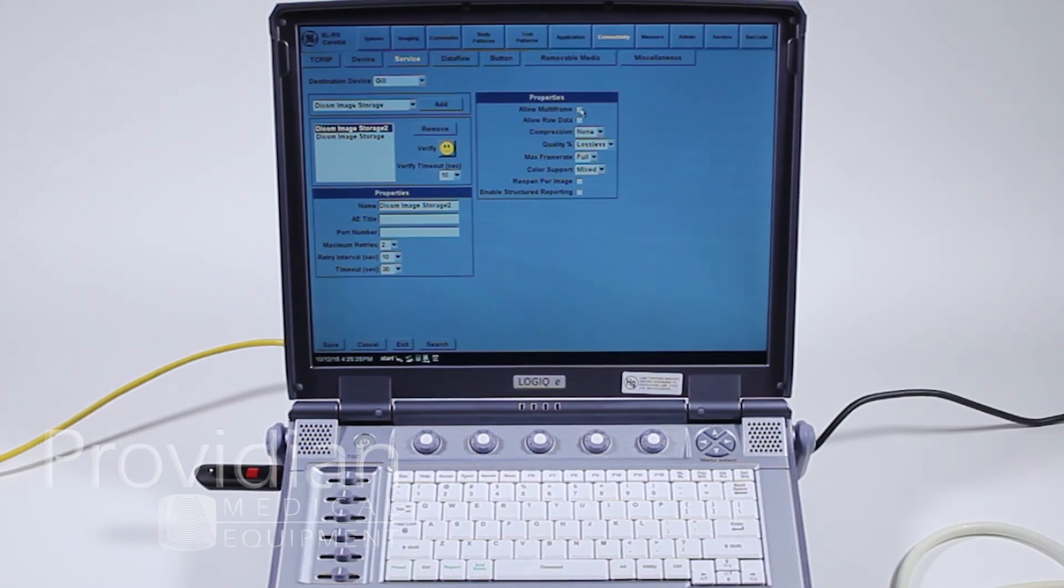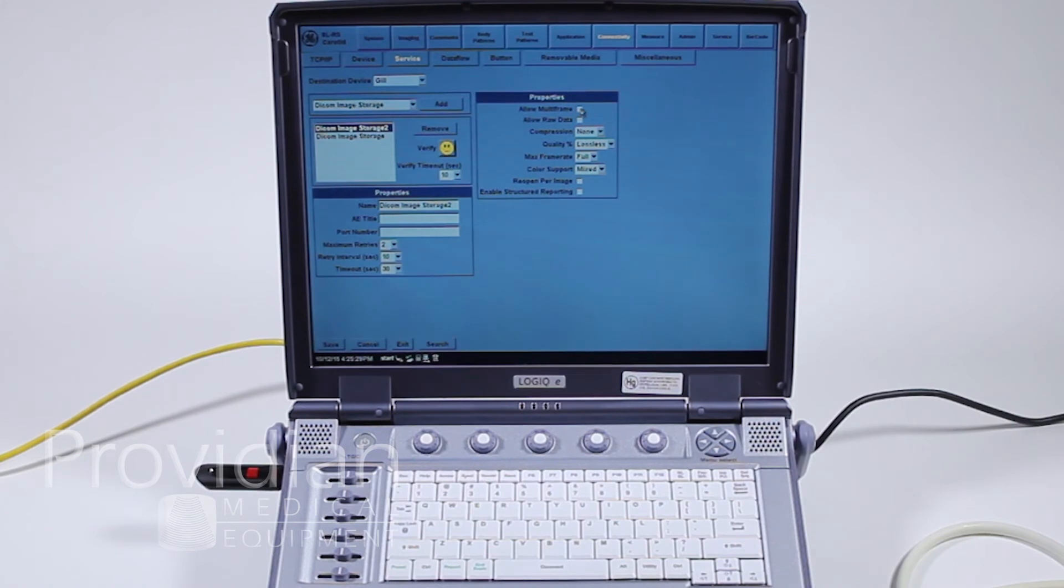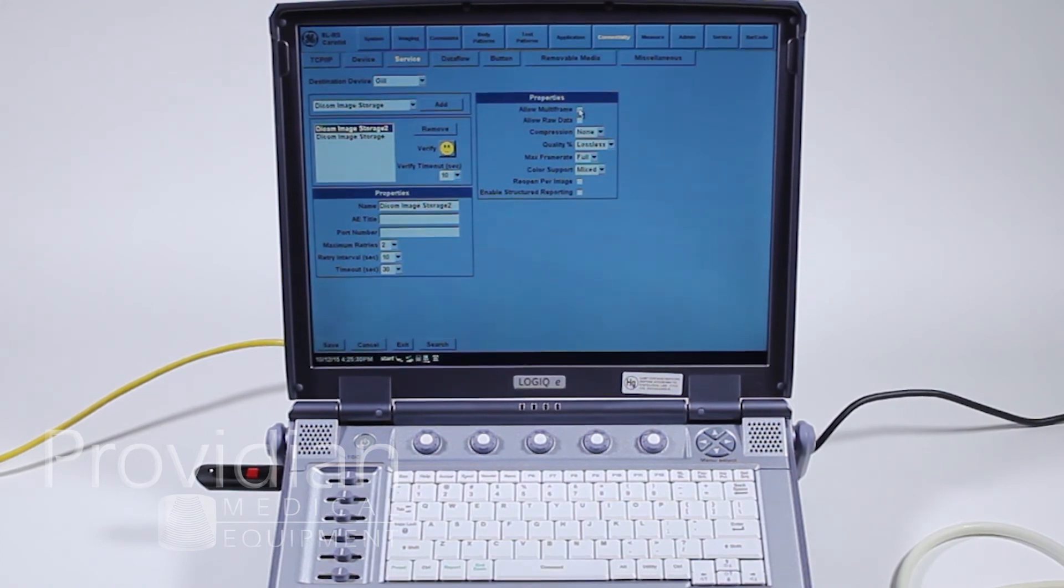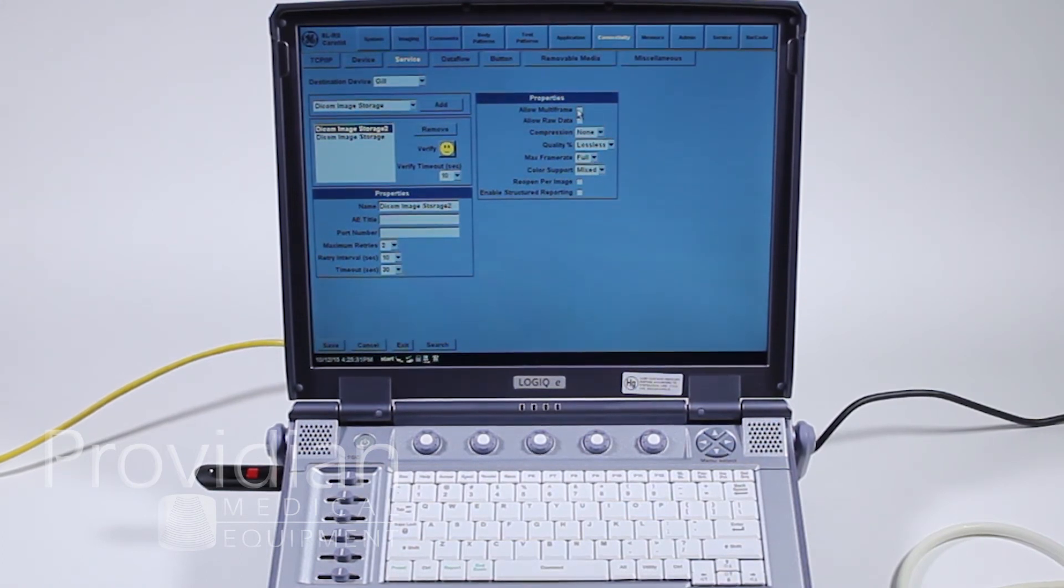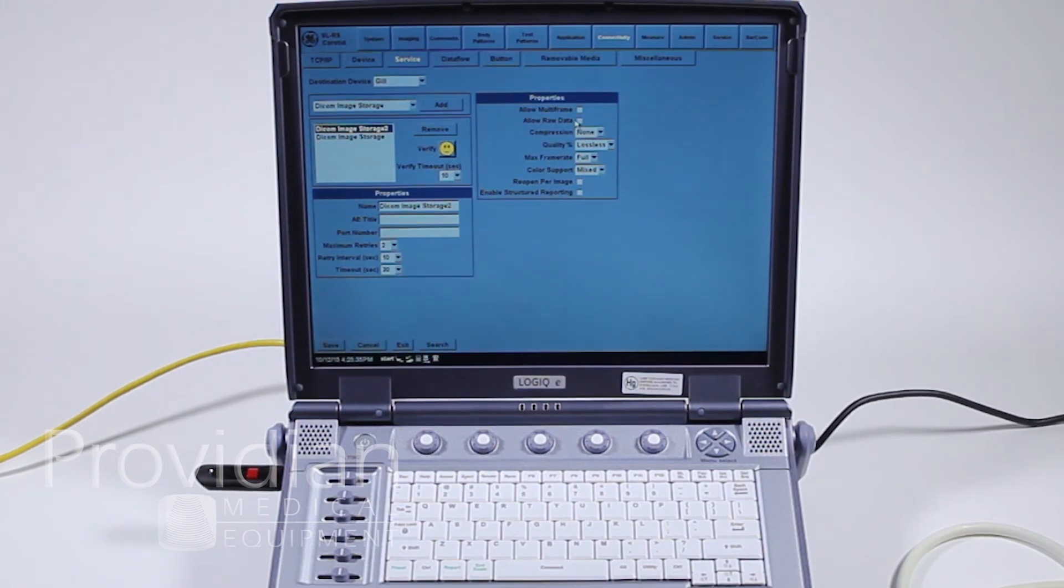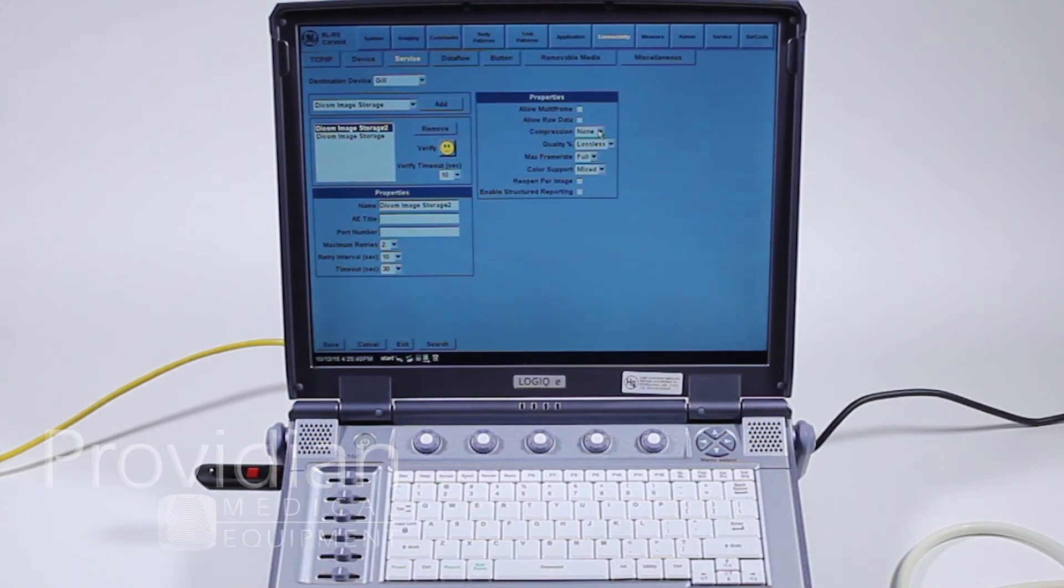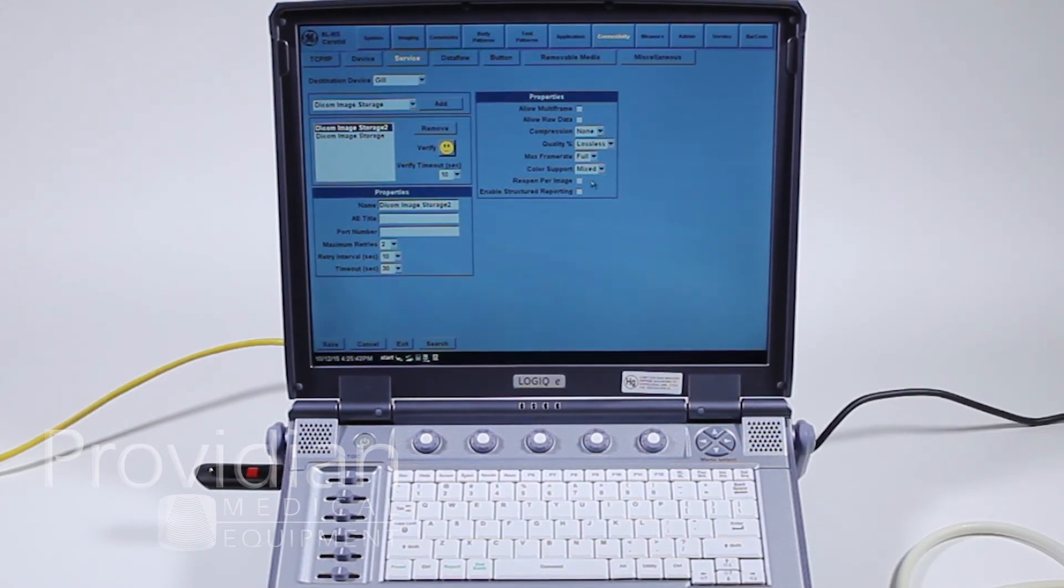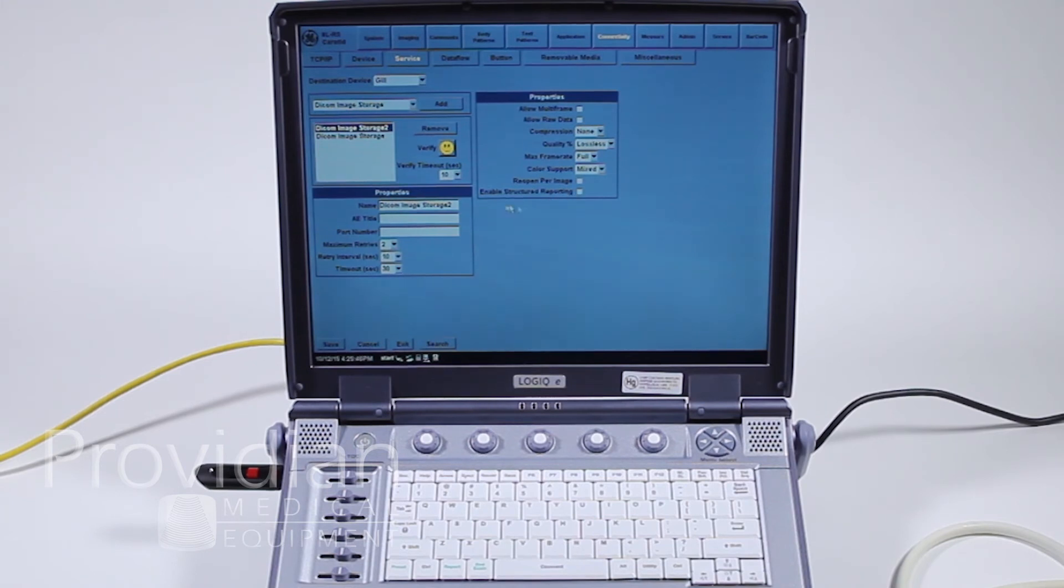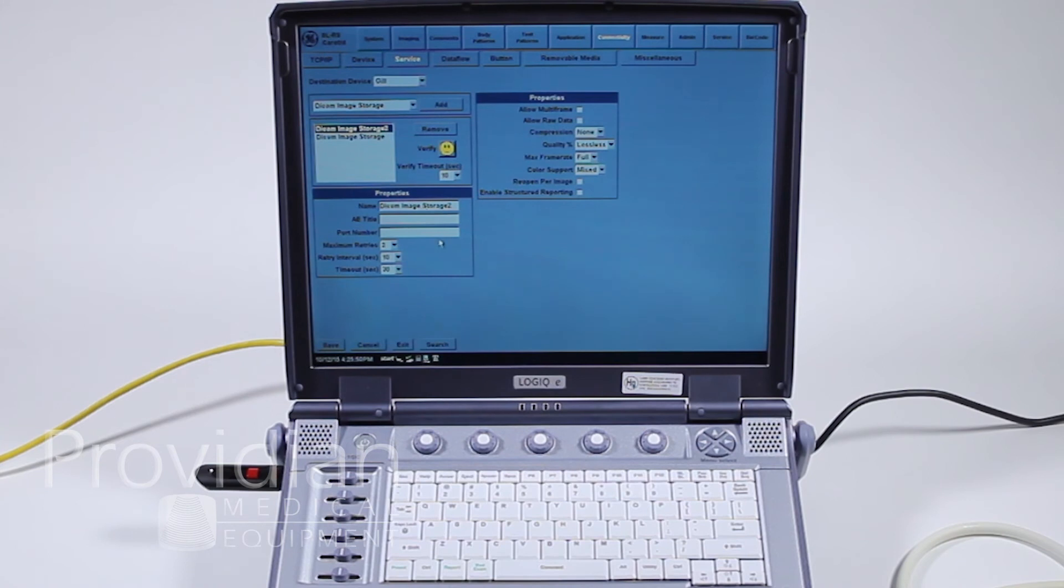Here we'll go across. Allow multi-frame allows you to save cine loops across the network. If you have it checked and you have a lot of cine loops, it will clog up the network and take a little bit of time to transfer. Raw data allows you to import it into another system and make adjustments. I typically wouldn't allow any compression. I would leave it as lossless, especially in a DICOM, and structured reporting. These are more things that your IT person may want.